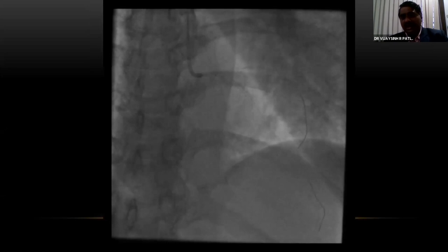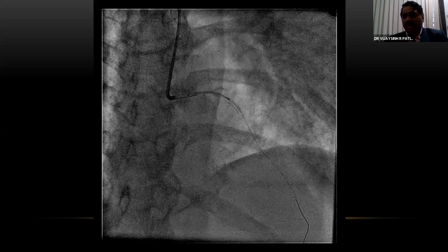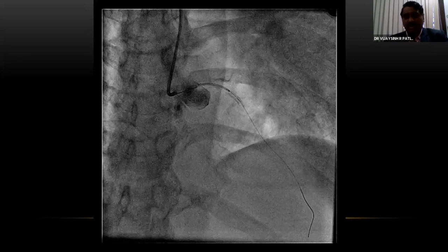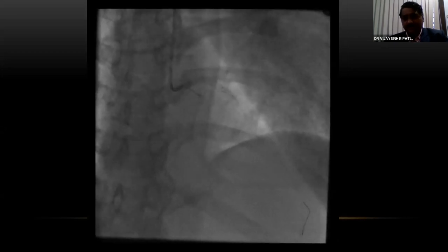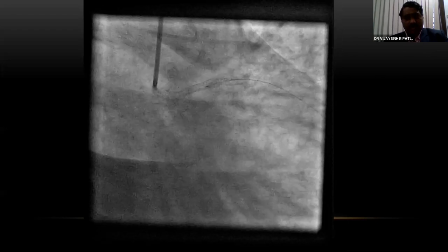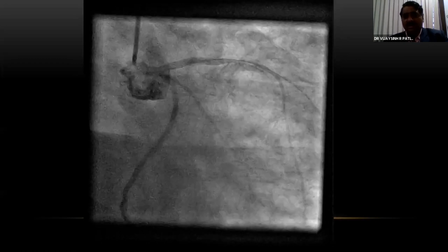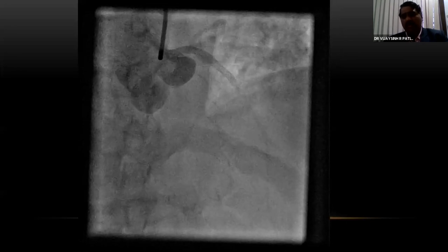We took a stent. It was a 3.0 by 28 everolimus polymer stent, which was placed from the left main ostium to the mid LAD with the overlap. This was deployed at 18 atmospheres. After this dilatation, again, the patient collapsed, but immediately improved after the adrenaline and, I think, nicorandil. The patient improved subsequently. A POT was done to the LM ostium with a 4.0 balloon. The patient had good TIMI 3 flow at the end.